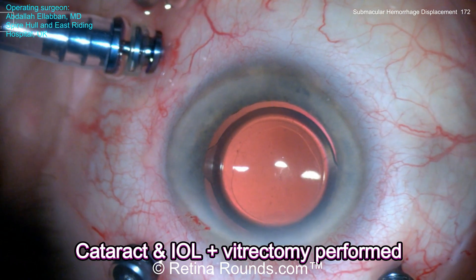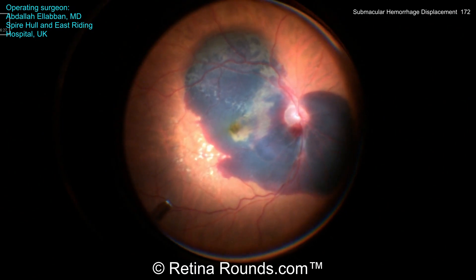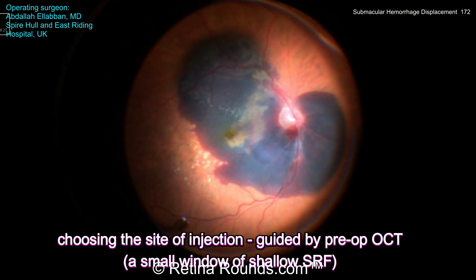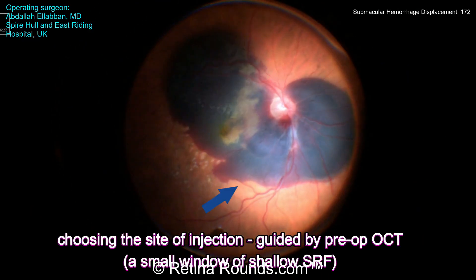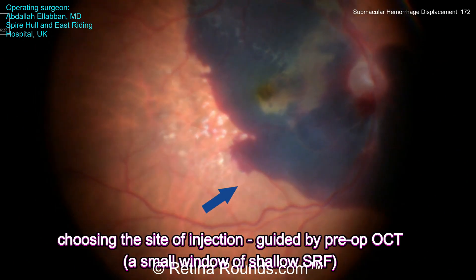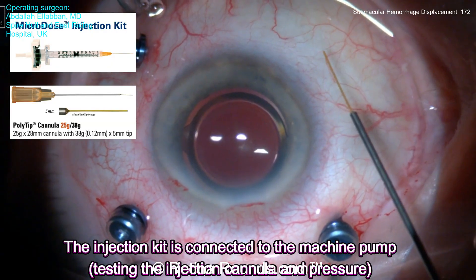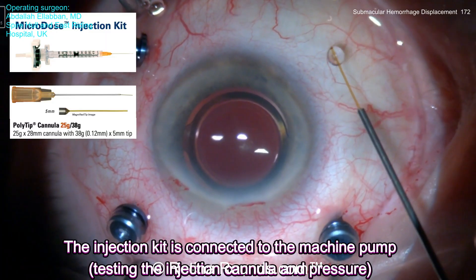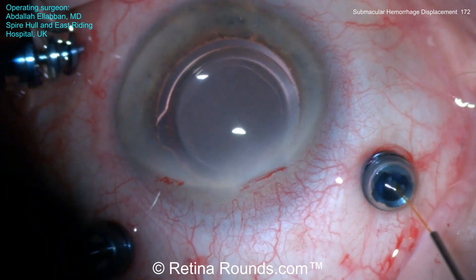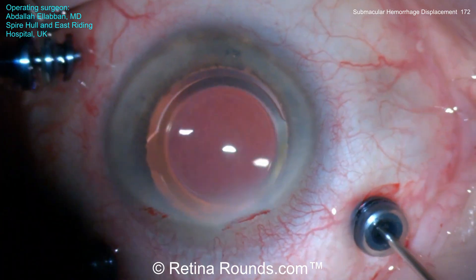At this point in the surgery, a cataract extraction with lens implantation and a pars plana vitrectomy have already been performed. Dr. El-Aban is now looking at the posterior pole to decide where he wants to inject, also using his preoperative OCT to make that determination. The blue arrow here is the area where he's going to inject because there's an adjacent area of subretinal fluid, which creates some space for him to inject. He's using a 38-gauge subretinal cannula attached to the machine using a microdose injection kit.